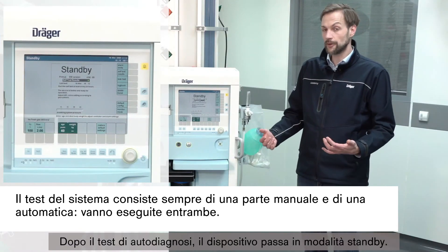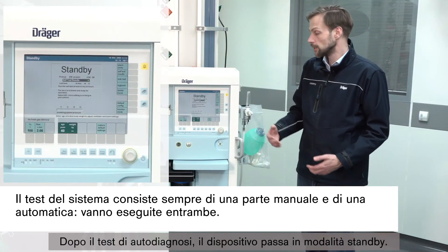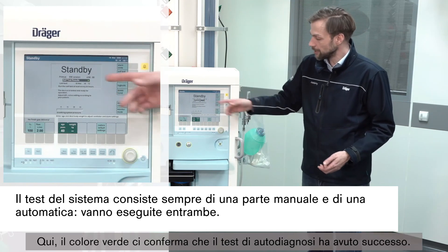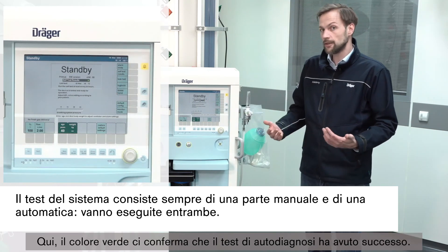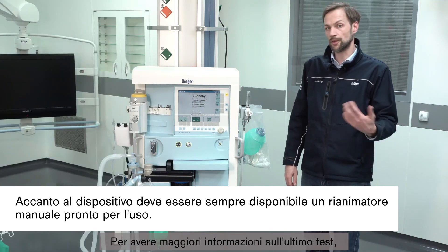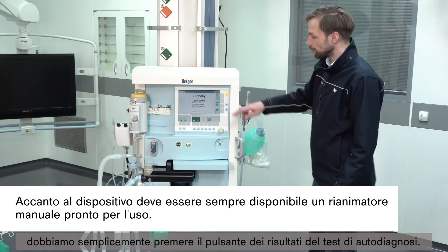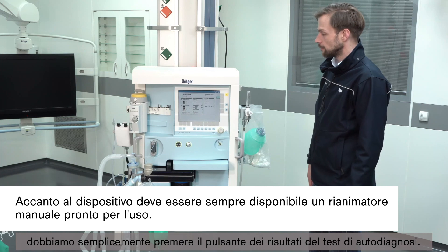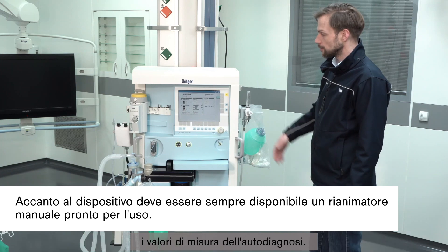After the self-test, the device will switch into standby mode whether the test was successful or not. Here we see, indicated by the green color, that our self-test was successful. To get more information about the last self-test, we simply press the self-test results button, and we can see all the test results and measurement values from the self-test.